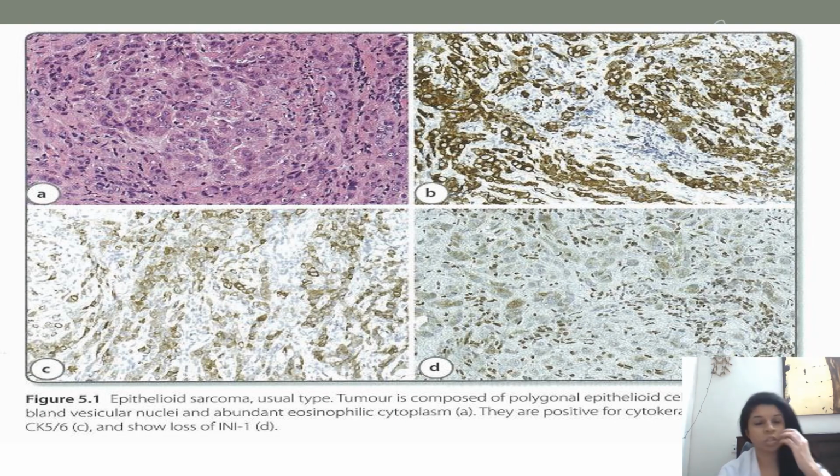So histologically, as you can see, there are nodular aggregates of epithelioid cells that have abundant eosinophilic granular cytoplasm with vesicular nuclei and prominent nucleoli. And this characteristic of each cell is the same morphology that will be seen in most of the epithelioid morphology that I'm discussing. That is abundant eosinophilic granular cytoplasm, vesicular nuclei, and prominent nucleoli. The other features that distinguish are they are seen as confluent groups, and then they are surrounded by spindloid cells that are fibroblasts. They are spindly stromal cells.